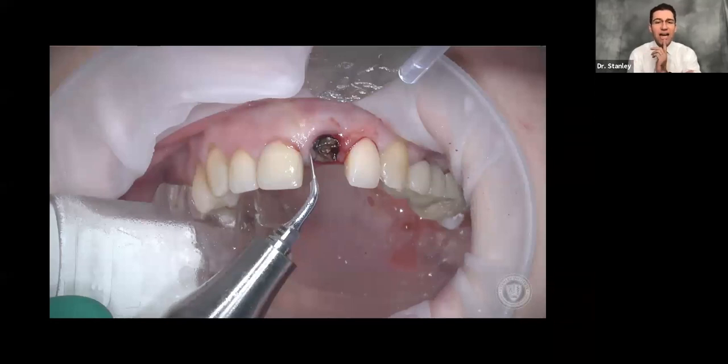But never on the facial, and why is that? Because the literature shows clearly that the bone on the facial is typically one millimeter or thinner. So we don't have a lot of bone on the facial to work with, and if we lose that bone, we might have an aesthetic concern down the road with a dehiscence. So we stay away from the facial — you don't need to worry about it. That's what we use the piezo for.